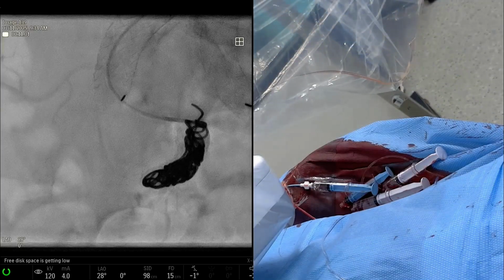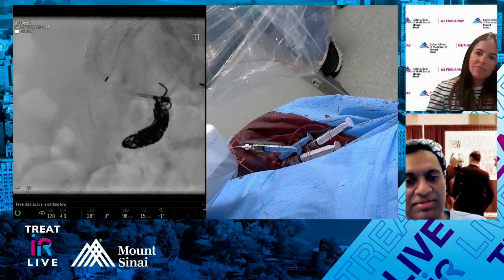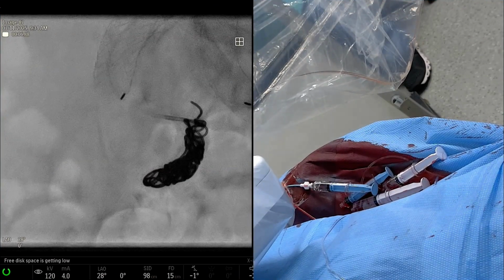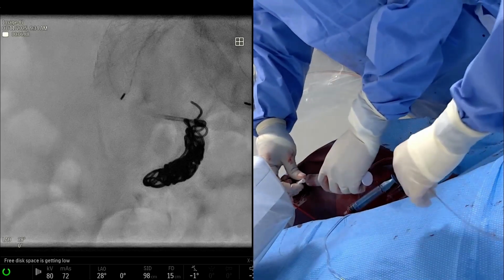Can we get another 30? Sometimes the packing coils will go into that ostium. They'll just get into the branch. So I think we were having issues when you had to pull it out first, and then pull it from the loop. They call it staging liquid metal.